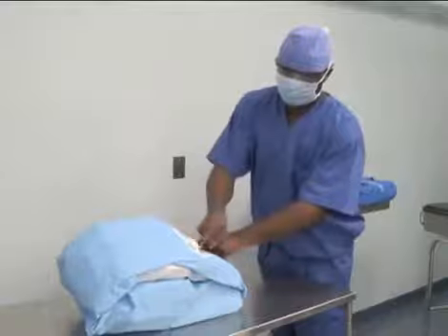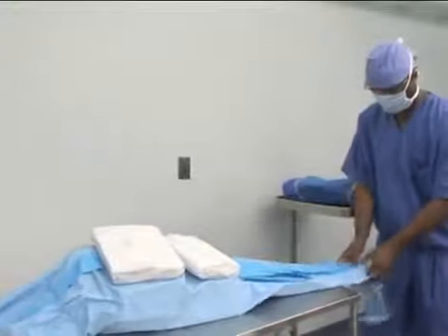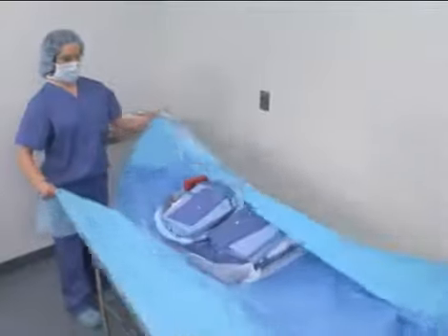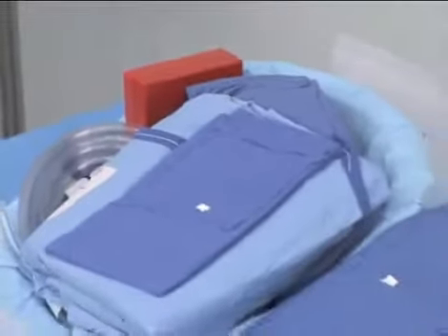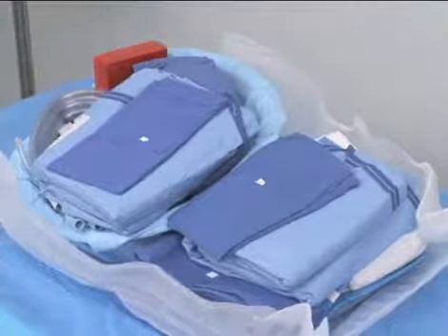Large packs are included in almost all surgical setups and are always opened first on the back table because that is the center of the scrub's work area. These include linen or non-woven gowns, towels, sponges, and other items. Pre-assembled case packs can be custom designed by the institution to include surgical supplies routinely used during specific types of surgery. Some commonly pre-assembled packs include abdominal, orthopedic, and minor surgery packs.